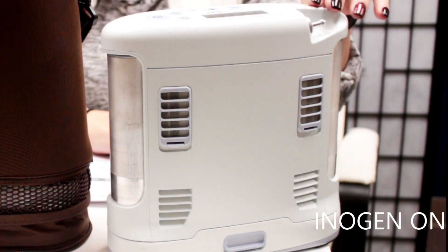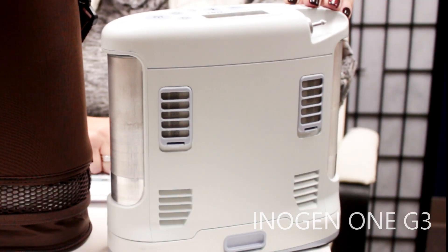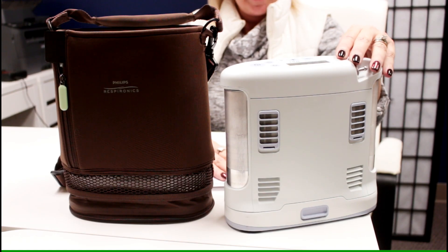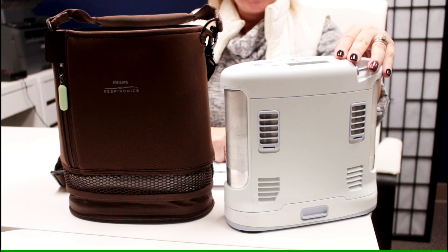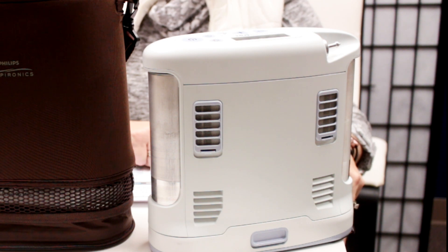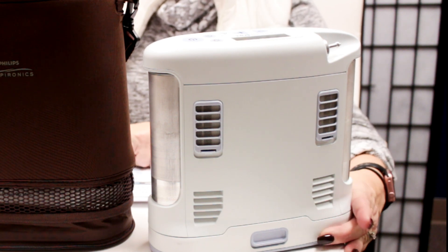I'm going to quickly go over the specs of a couple of our pulse flow units that we carry here at LPT Medical. The first one is the Inogen 1 G3, with a 16-cell battery. The dimensions are 8.8 inches in length, 8.3 inches in height, and 3 inches wide. It only weighs 5.8 pounds, so it's very light and you could carry it anywhere.